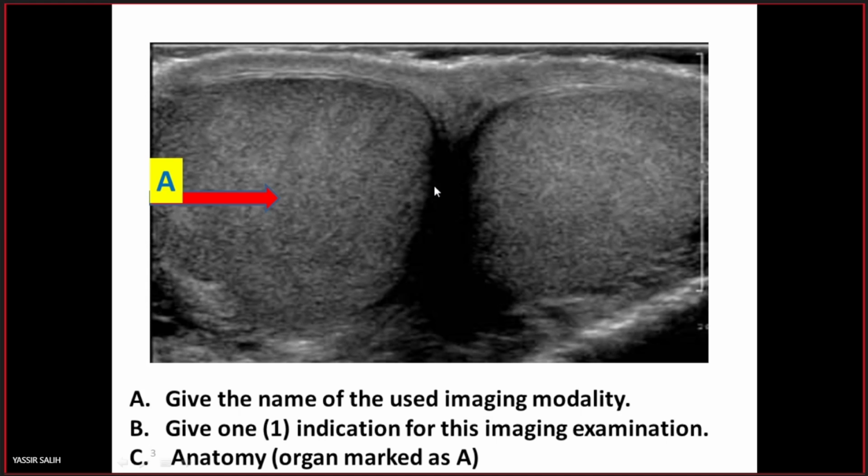Give the name of the used imaging modality in the given image. Ultrasound. Yes, US, ultrasound. Abbreviation, is it written right? Okay. Give one indication for this imaging examination. This is a common question. That is the commonest indication. Swelling and pain.